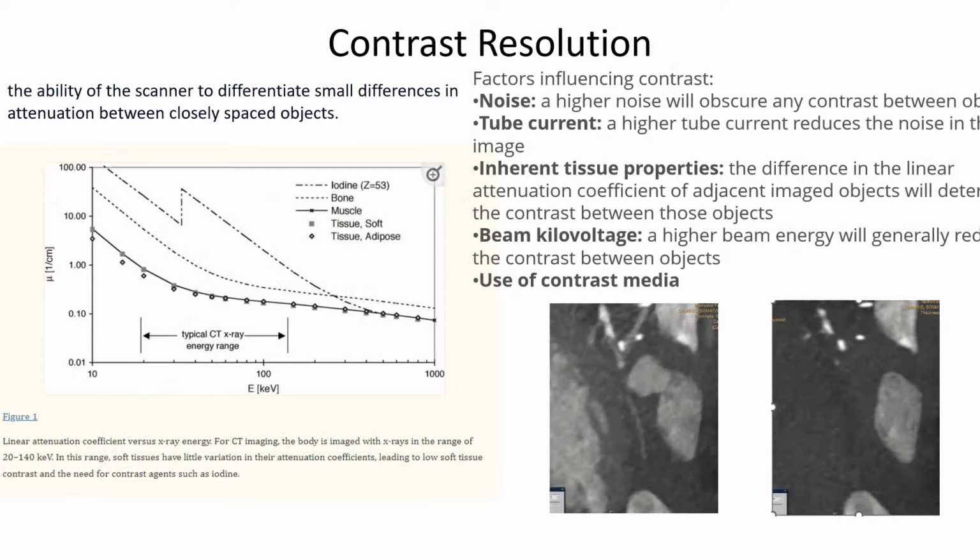because of that subpar temporal resolution. Okay, and this is something we don't discuss often, called contrast resolution. It's essentially differentiating different structures. For instance, this is a patient with acute coronary syndrome and chest pain, so this is a planning scan before we give contrast.